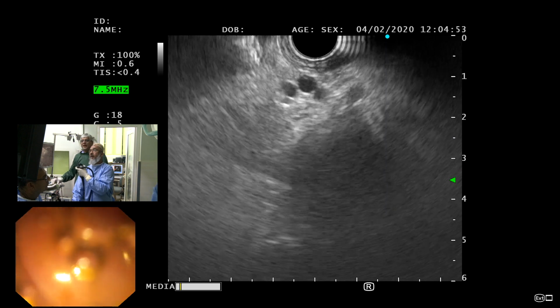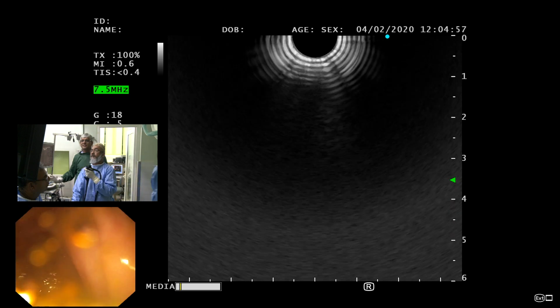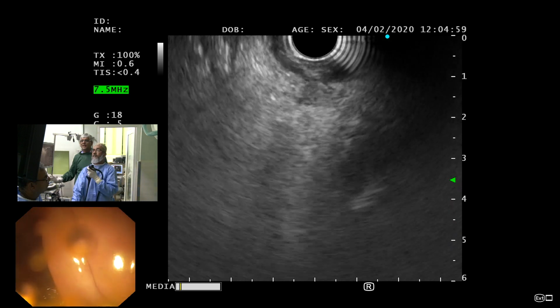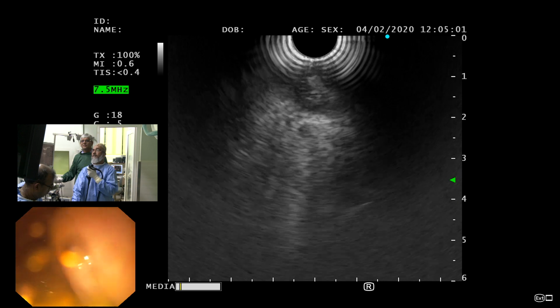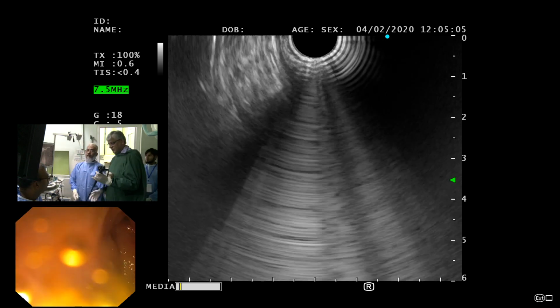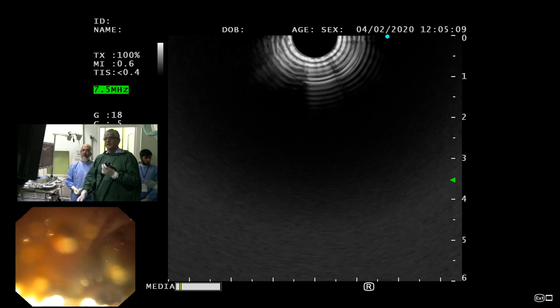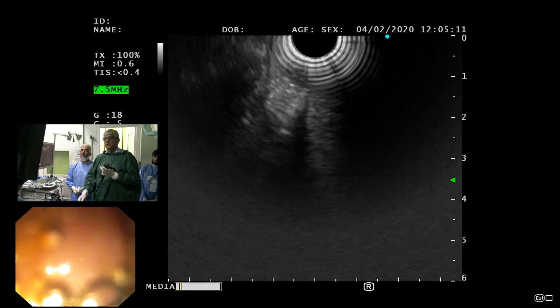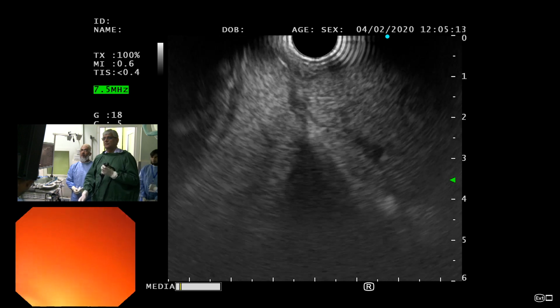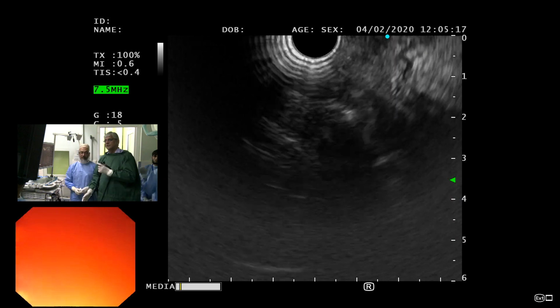So we go back. We won't waste time. We will go back to something that we understand. So if you're not sure, we go back and try and find the aorta. So let me show you एक चीज़ दिखाता हूँ. ठीक है. आपने ये पकड़ा है ना इसको. ठीक है. आप एक तो एयर निकालें. ठीक है ना. एयर निकालने के बाद we are here, right? राइट. ठीक है.